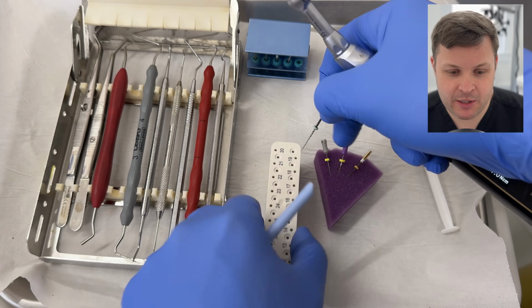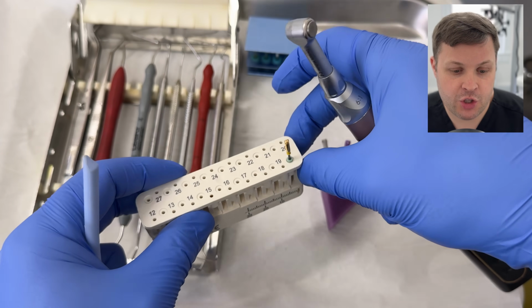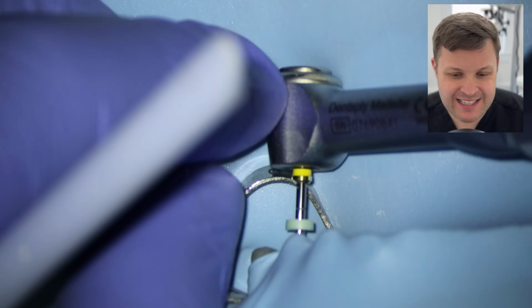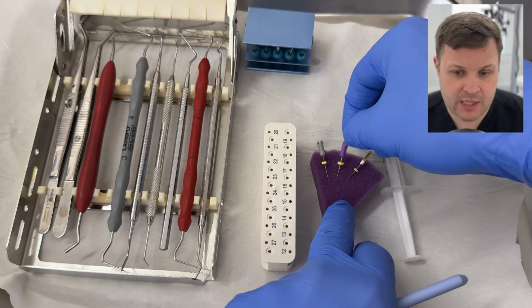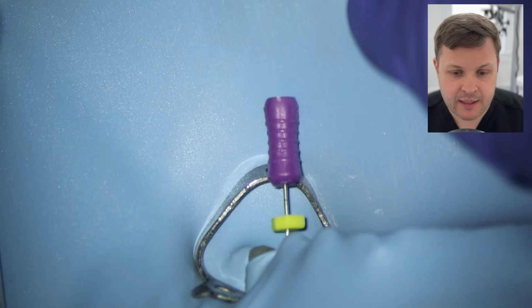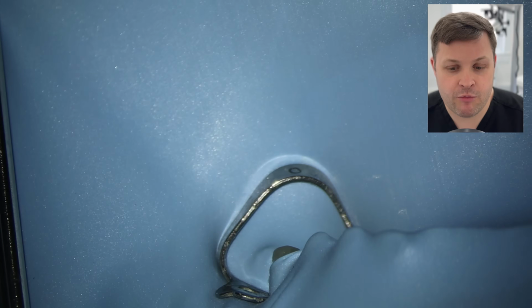And again, recapitulation. We're now going to do our final shaping with a size 20 file, and we're going to do it at 19.5 millimeters. And this isn't quite reaching 0, so again, I'm not going to push this too much. I'm not going to just force this because you're going to cause a ledge. I'm just going to recapitulate with a size 10 K file. This is all in the palatal, by the way. And once we've recapitulated and we've irrigated, the 20 is now reaching 0.